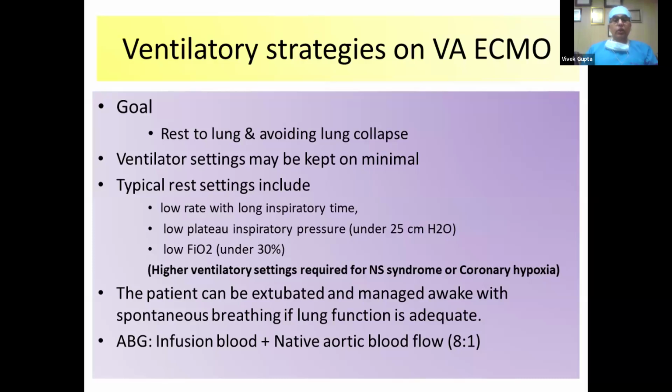We keep the patients on rest settings. We'll be discussing in detail the ventilatory strategy. Our purpose is to keep a low plateau pressure. We gradually reduce and we keep FiO2 low.